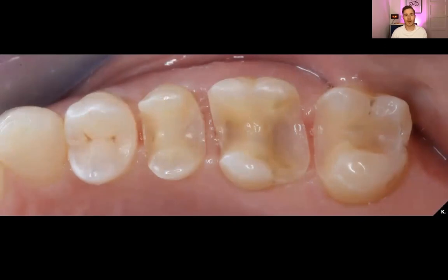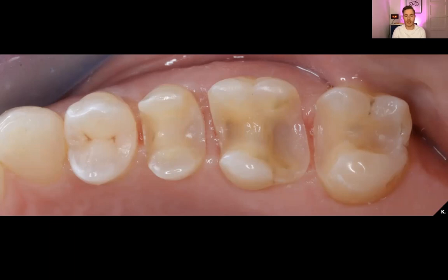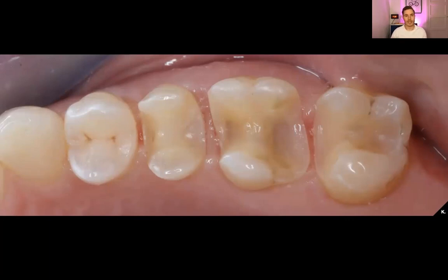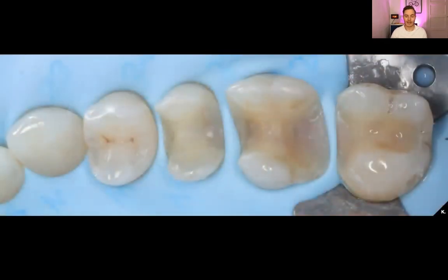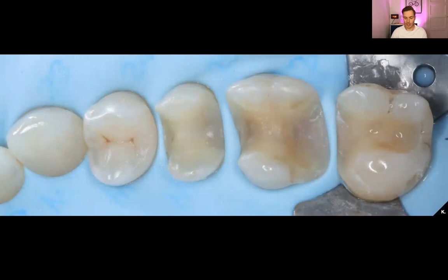The patient comes back after around three to four weeks and this is what the situation looks like after removing the temporary restorations. You can see that the gum looks quite healthy, all the margins are above the gums, and it makes my life easier when I want to cement the indirect restorations. Now I isolate the teeth again — this is what it looks like.